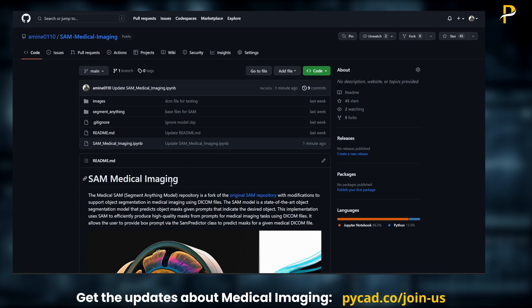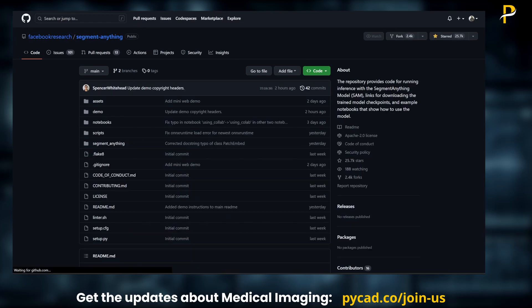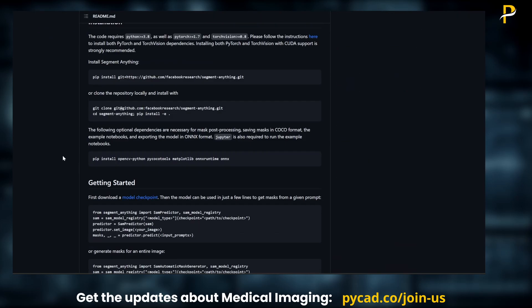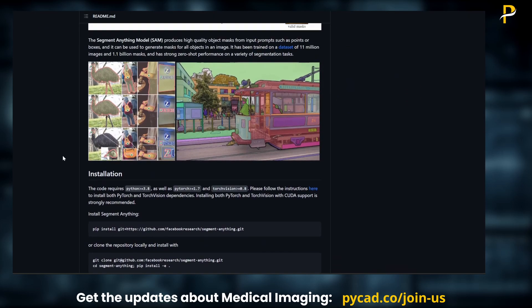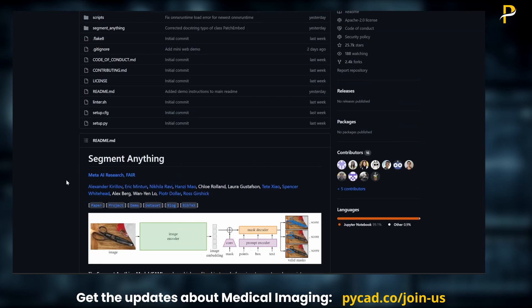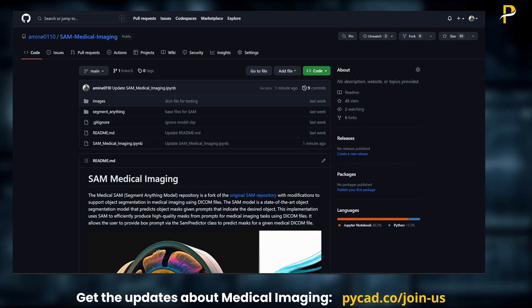I created this repo just to show an example of how to use SAM for medical imaging. If you want to see the original repository, it is here — facebook research slash segment-anything. You can find everything about the model there: the paper, a demo, projects, and anything else about this model in the original repository.